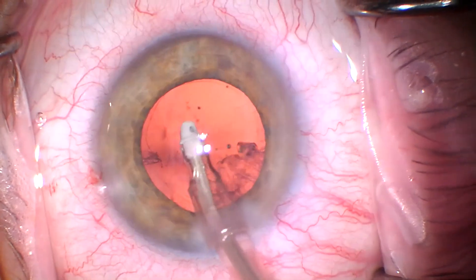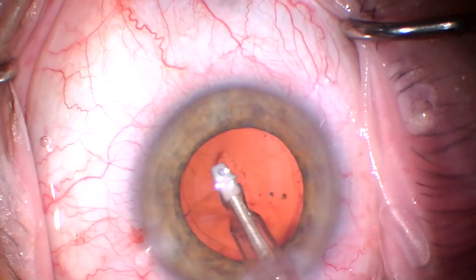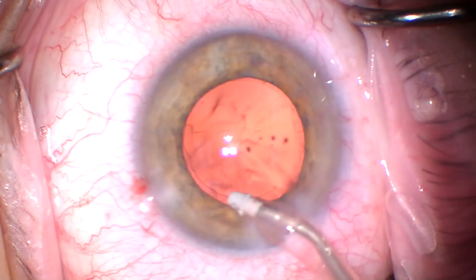I probably should have infused BSS during my changeover from FACO to I&A, especially given that this is a myopic eye. I do believe she already had a PVD though.